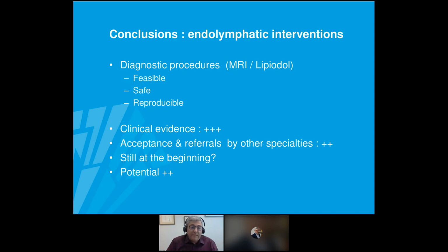That might be quite an aggressive approach, but you do it not really blindly, you do it under fluoroscopic guidance. And you do the puncture with a Chiba needle, which is a 23, 25, even 27 gauge needle. This is a very fine needle. The Bonn group recently published a paper on the side effects or the collateral damage of such a puncture.